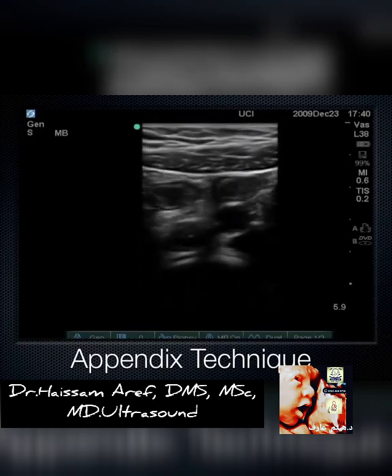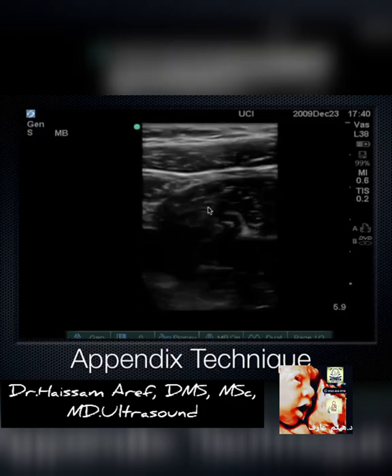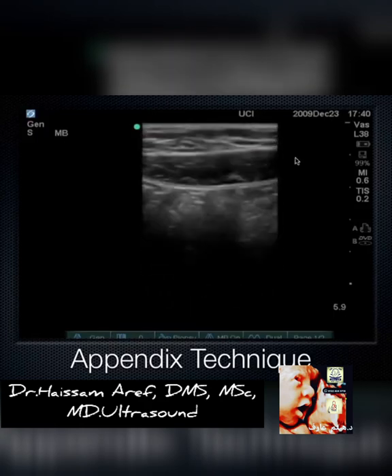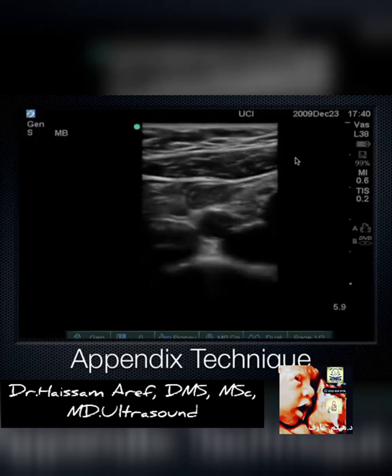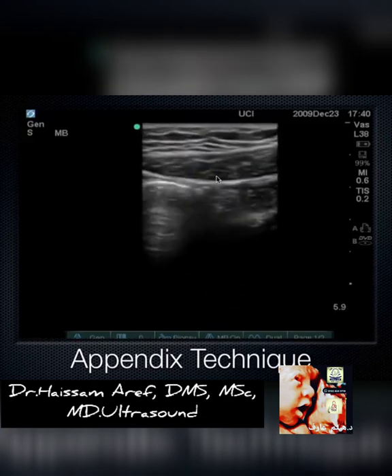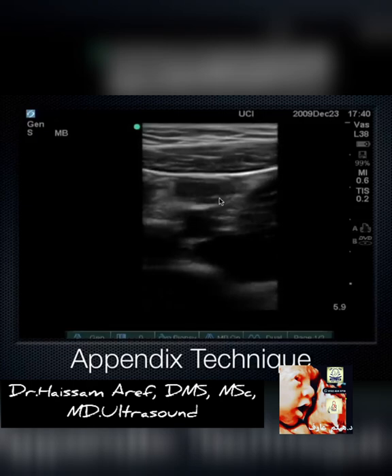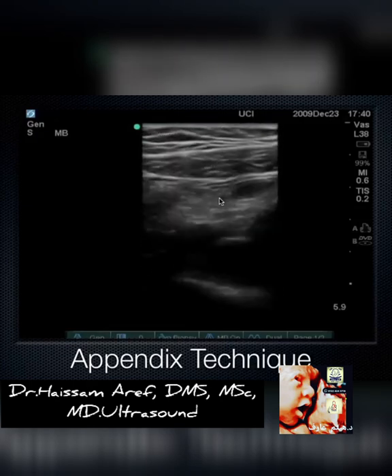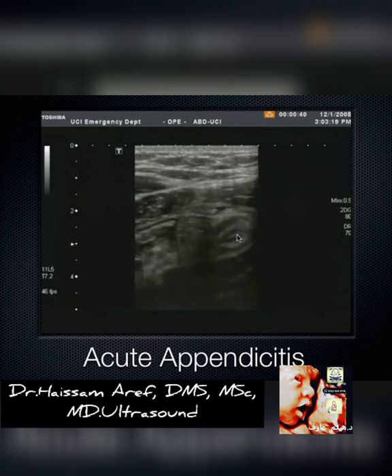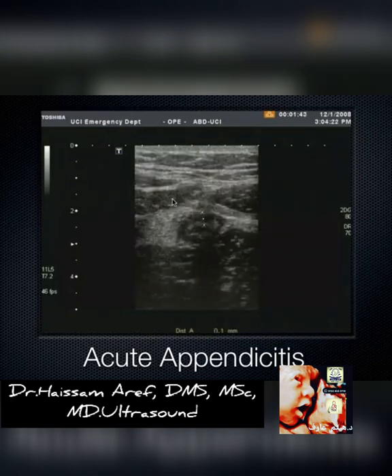This is the graded compression technique. After adequately providing analgesia, you go in and compress. The psoas muscle comes in contact with the abdominal wall musculature. You're going to be looking for the psoas as you push. For the model's sake and your patient's sake in the future, have the patient bend their knees — that makes the abdomen a little more doughy and easier to compress. This is what a positive appendix looks like: acute appendicitis compressed between the psoas musculature and the abdominal wall musculature.